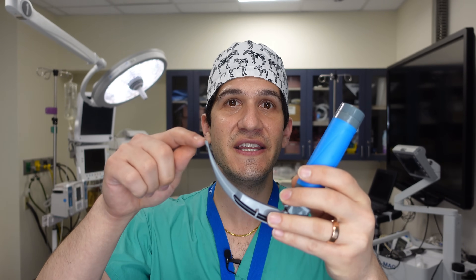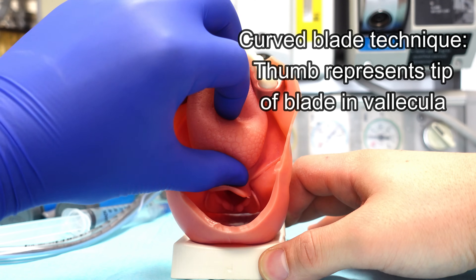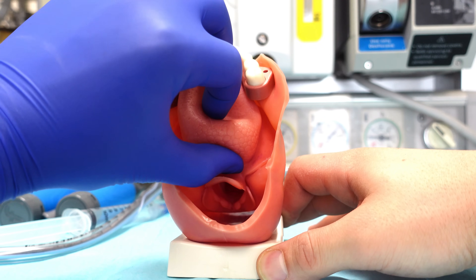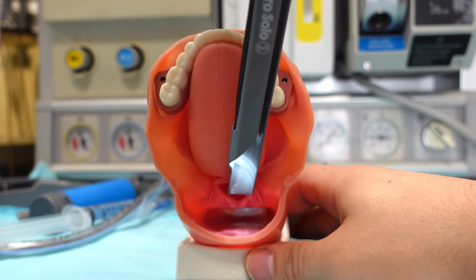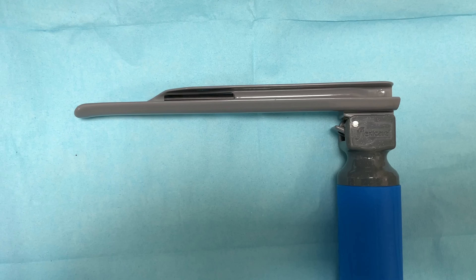This curved Macintosh blade is designed to sit in the space just at the base of the epiglottis — called the vallecula — and then act as a fulcrum to lift up the epiglottis indirectly and reveal the vocal cords underneath. By contrast, the Miller straight blade is designed to directly pick up the epiglottis and move it out of the way, thereby revealing the vocal cords. You can see that this Miller straight blade has a little bit of a flange on the end of it, which is designed to easily scoop up the epiglottis and move it out of the way.